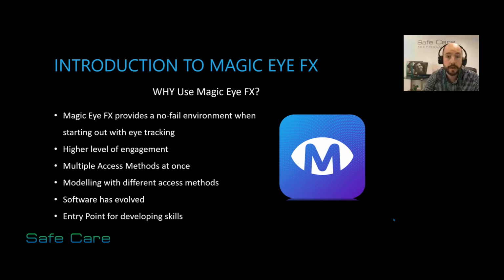Also, there's the modeling with the different access methods. While the user is using and engaging with the screen, the instructor doesn't necessarily have to go and touch the device. That's the important thing. You might have found with previous sensory software that, in order to get the engagement going, sometimes, especially on a level 1 game, the user is looking at the screen, or maybe looking away, and there's no attention or no engagement on the screen.